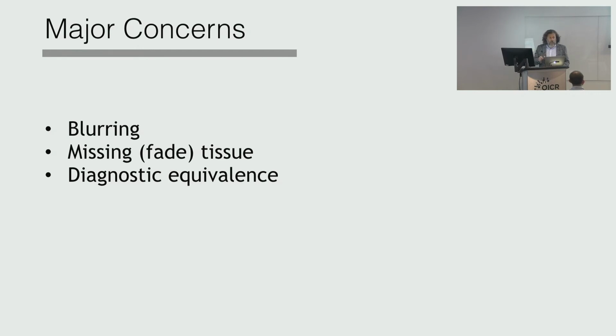We cannot afford that. And this is one of the things that every single company in the field is working day and night to make sure does not happen, because if this happens, that diminishes the value of digital pathology. But by far, the most serious concern is diagnostic equivalence.